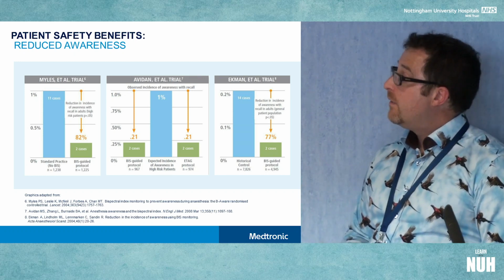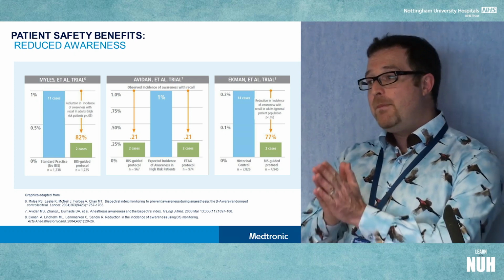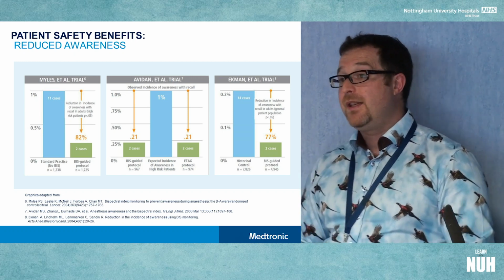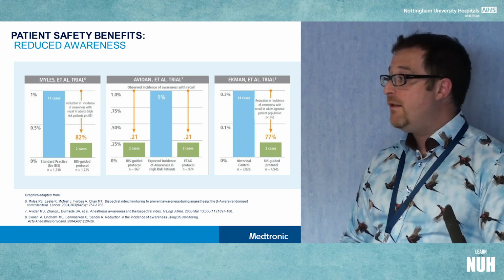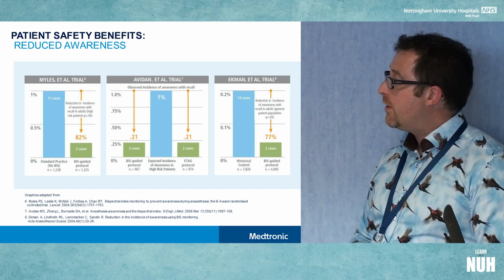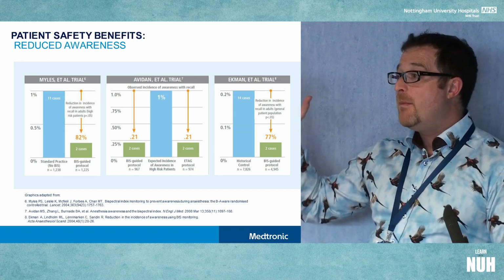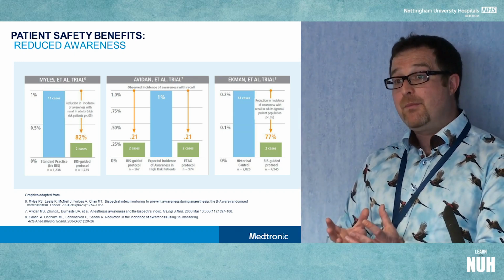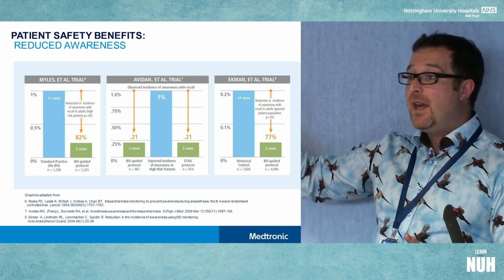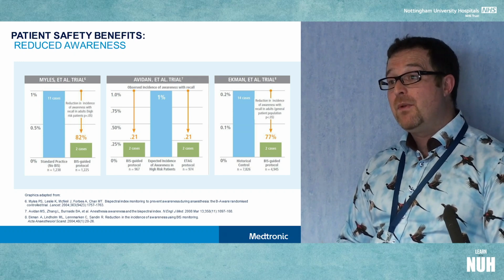In terms of awareness, the Myles and Ekman studies on the left and right you may be aware of, and they show BIS-guided anaesthetic compared to standard anaesthesia and show significant reductions in awareness in high-risk patients. The centre study by Avidan, sometimes referred to as the BAG-RECALL study, analyses patients that had BIS at high risk of awareness and patients that had an end-tidal MAC protocol of between 0.7 and 1.3 MAC, and that showed an inconclusive result where both techniques seemed to reduce awareness to quite low levels.